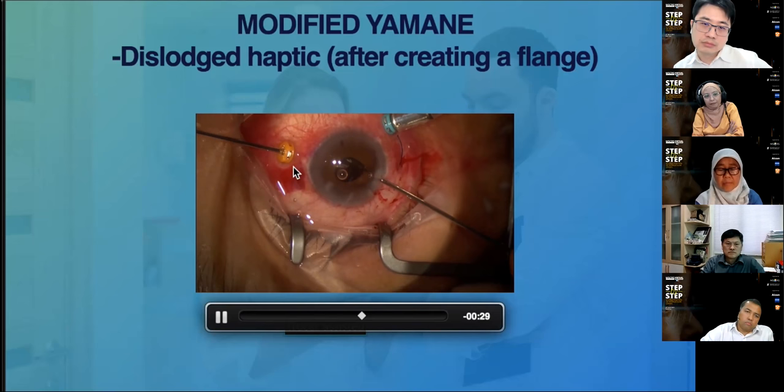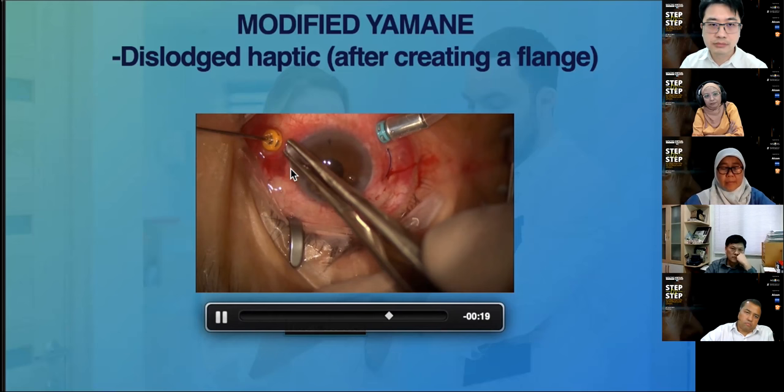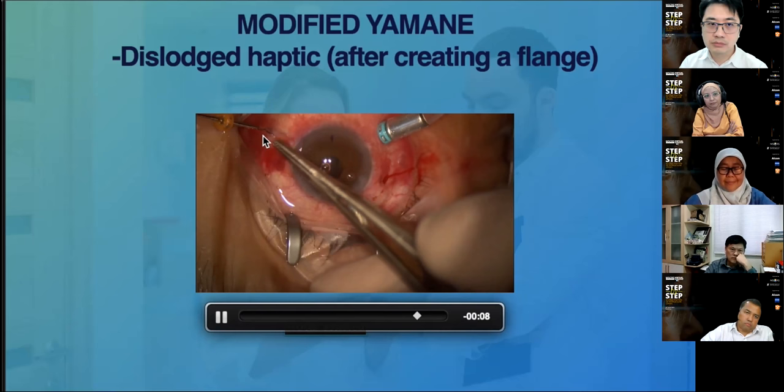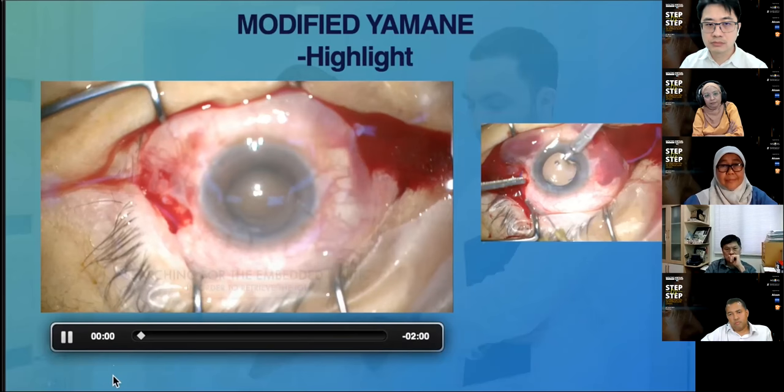So again, we are using a trocar, because if you can imagine, when you already have a flange, you cannot thread the haptic through the needle easily. So this is one of the techniques: manually grasp the haptic, and with the conjunctival forceps, remove the haptic by leaving the forceps still inside the eye, then only externalize it, then cauterize it. Again, we're able to do it without needing to dissect the conjunctiva. This was a case referred to us for failed externalization of the second haptic.